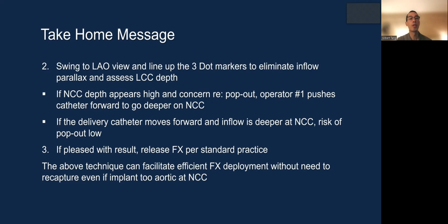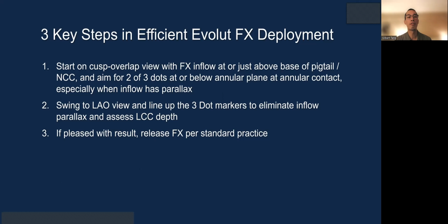So you swing to the LAO view and line up the 3 dot markers to take out the parallax and assess the LCC depth. If the NCC depth appears high, you should push the catheter forward to see if it goes deeper on the NCC. If it does move forward and the inflow is deeper than the NCC, then the risk of pop-out will be low. Therefore, you don't need to recapture and can just release the FX valve using controlled pacing per standard practice. This technique has really allowed us to reduce the risk of recapture and the need to do that, even if the valve was implanted a little bit higher on the NCC.